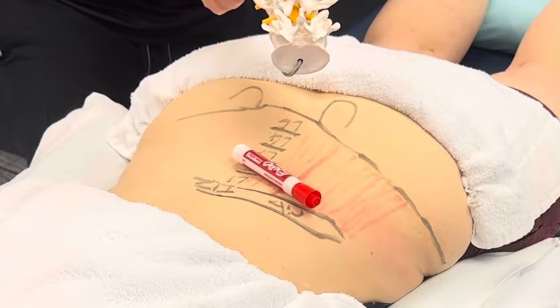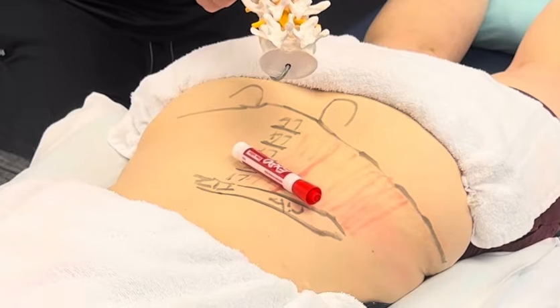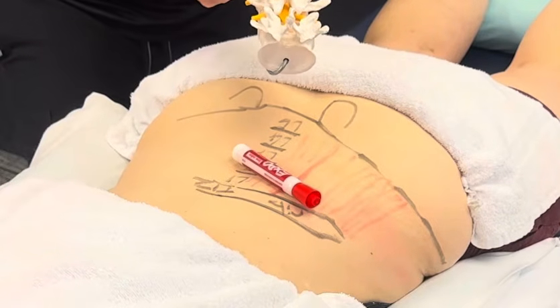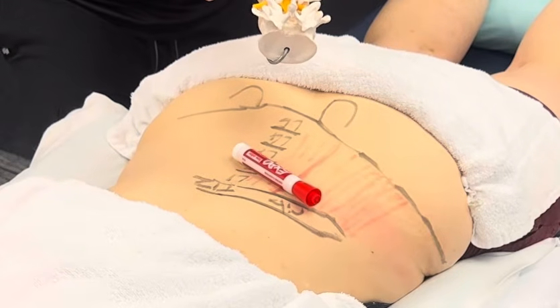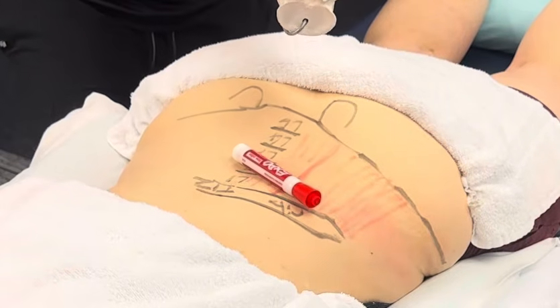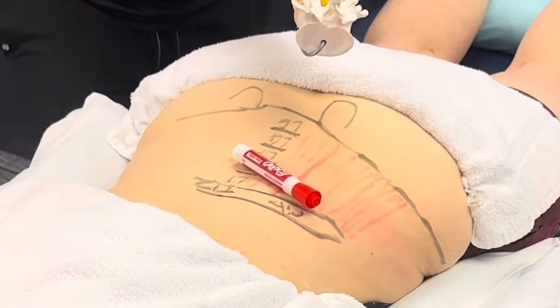We're gonna bracket our fingers, and we're gonna angle our needle. 45 degrees is safe. If you wanna be extra safe, you can go 60 degrees. And you're just gonna needle in full depth. We don't need any downward or upward component here. You can just go straight towards that.